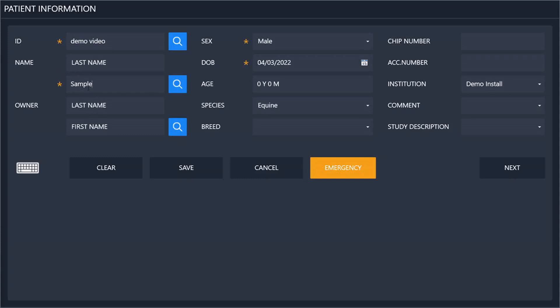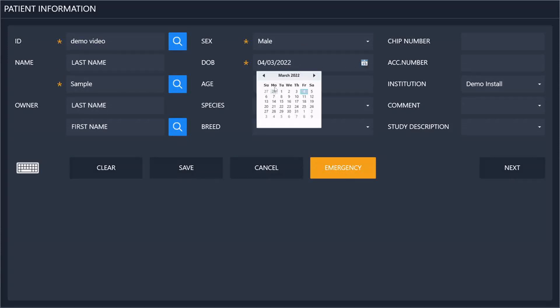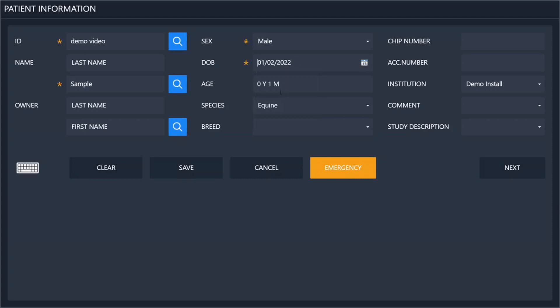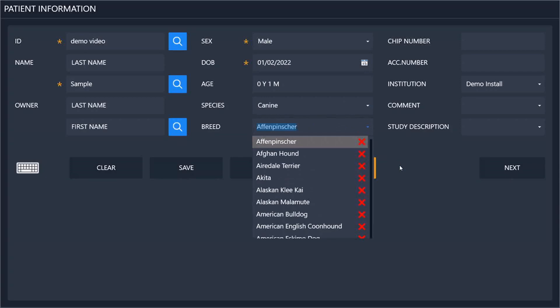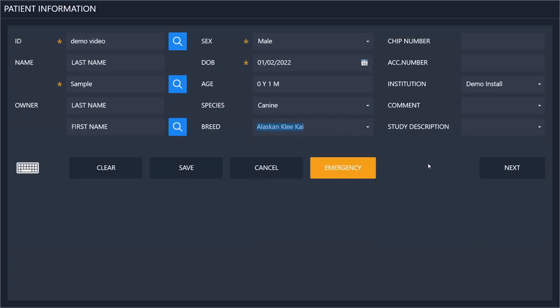I will create a new patient here. Just fill in the required information, which is the first name, the sex, and then select the date of birth either by typing it out or looking in a calendar. It will automatically calculate the age for you. Then you select the species and the breed of the animal. You can also put in a chip number and accession number and can select what institution you are taking the X-rays at.